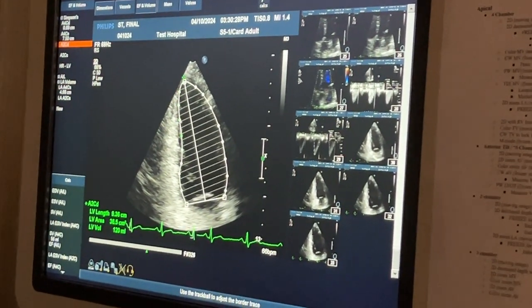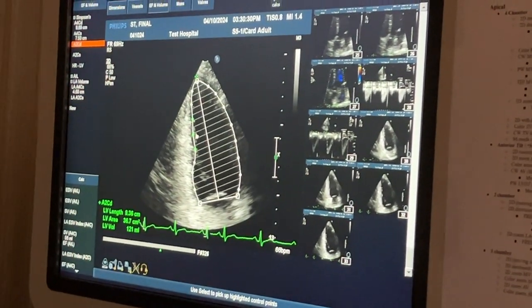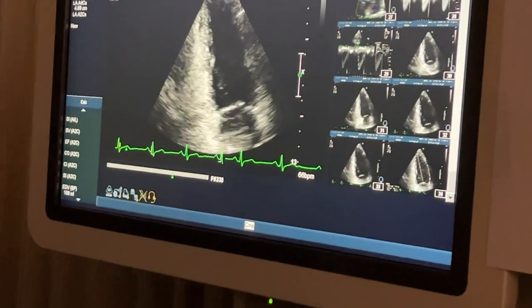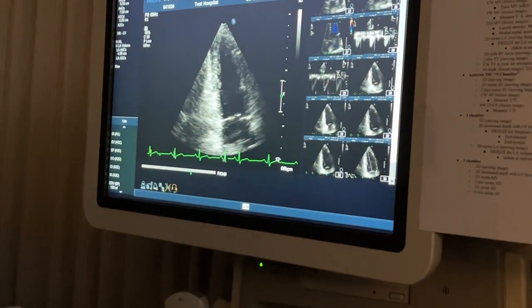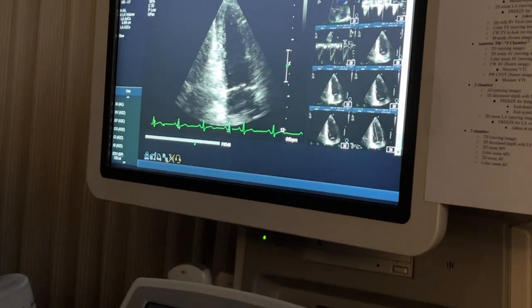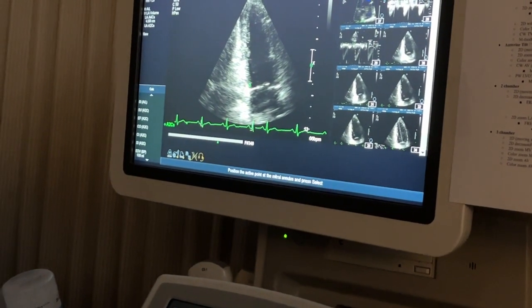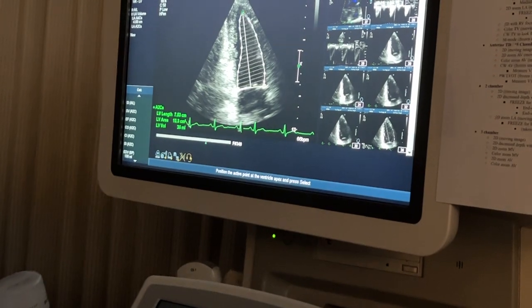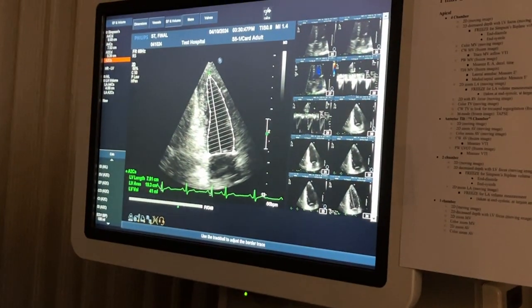I'm actually really pleased with this right away. I'm just gonna take it. And now I'm gonna get my pointer out of the way, scroll forward to end systole of the same cycle. Calc, apical 2-chamber. See everything. Look at this one.